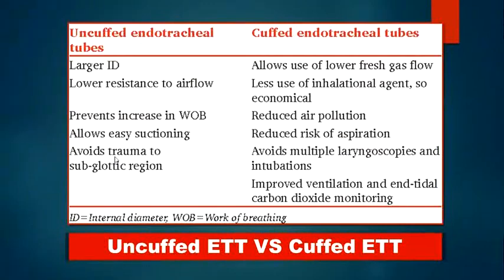You can see here the differences between both. The larger internal diameter is with the uncuffed tube. It is of larger diameter, it has low resistance to airflow, it avoids trauma to the subglottic region, and it always allows very easy suctioning.